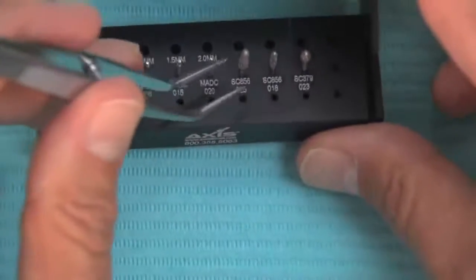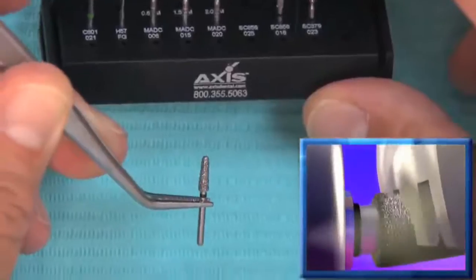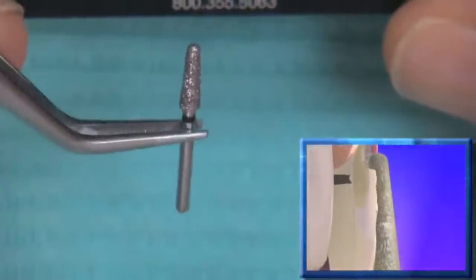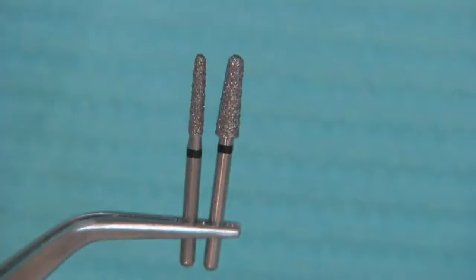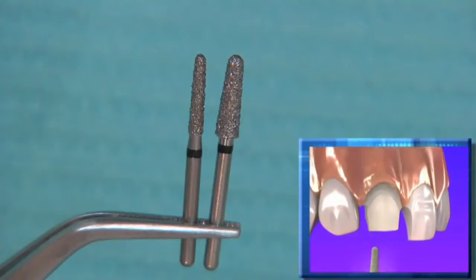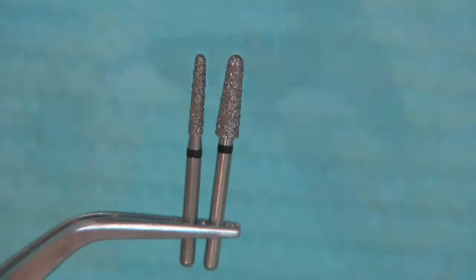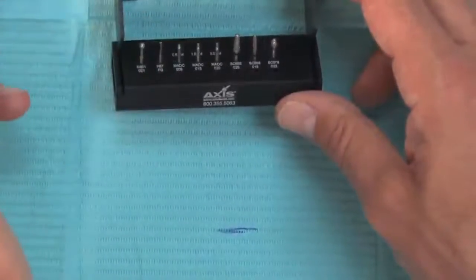The burr we do the majority of the work with is our 856025 super coarse grit burr. Once we've placed our depth cuts, it's a race to see how quickly we can get all the enamel off the tooth — this is our big workhorse burr. We place depth cuts with the other burrs, but this 856025 is going to do probably 85% of the reduction. If we're prepping a single unit crown it's going to be tight interproximately, so we use an 856016 — the same shape but a skinnier version. We use this interproximately on the mesial and distal, and once we create some additional space we can go through with our 856025 all the way around the tooth, including interproximately.